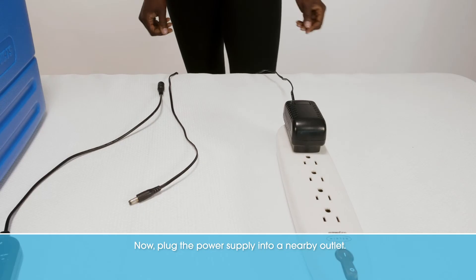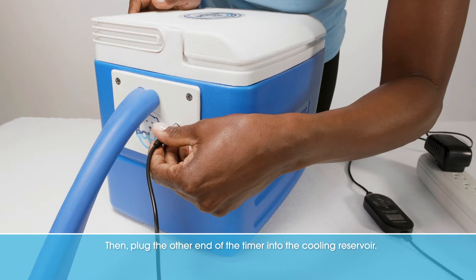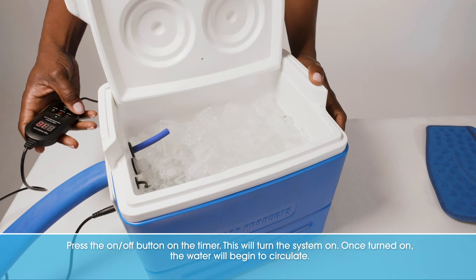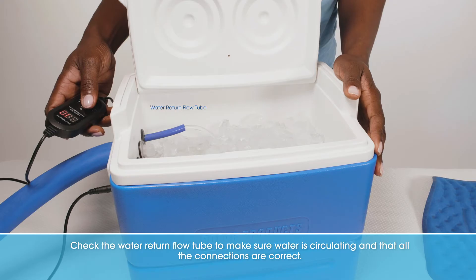Now, plug the power supply into a nearby outlet. Next, plug the timer into the power supply. Then plug the other end of the timer into the cooling reservoir. Press the on-off button on the timer to turn the system on. Once turned on, the water will begin to circulate. Check the water return flow tube to make sure water is circulating and that all the connections are correct.